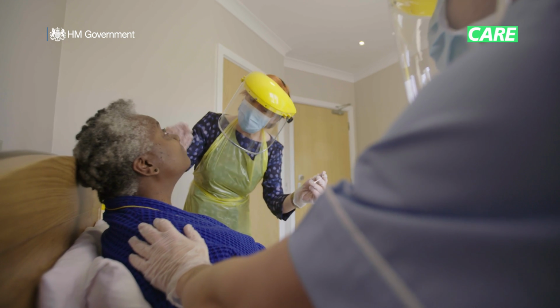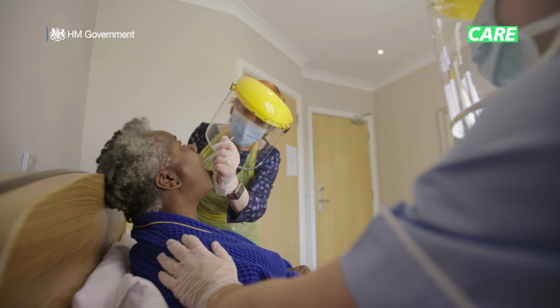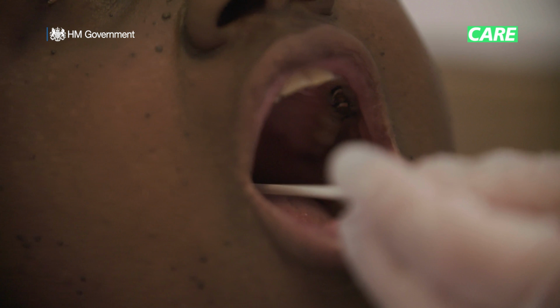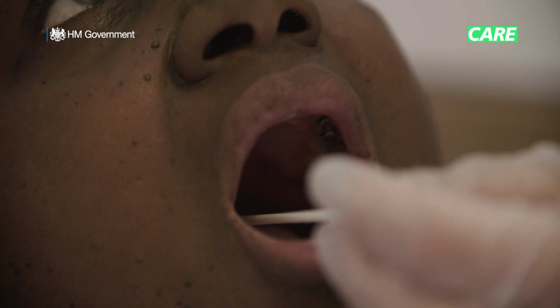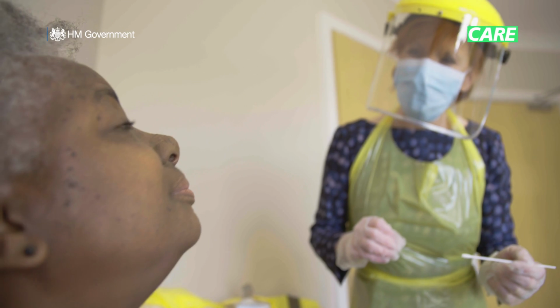Ask the person to open their mouth wide so you can gently rub the swab over both tonsils as well as the back of the throat for 10 seconds. Avoid touching the tongue, teeth, or gums. Carefully remove the swab from their mouth without touching anything.